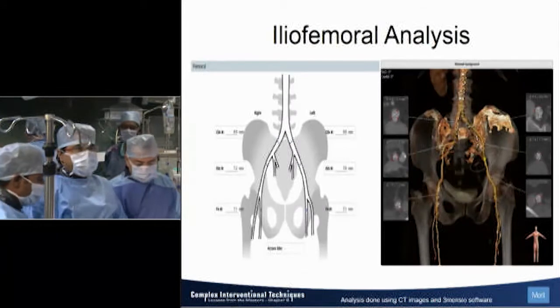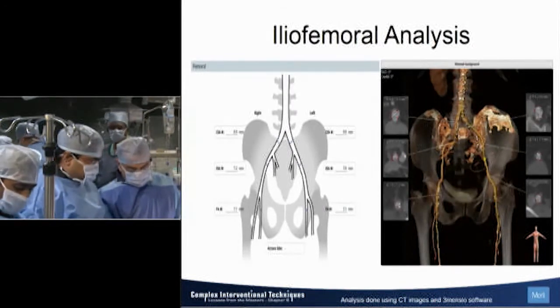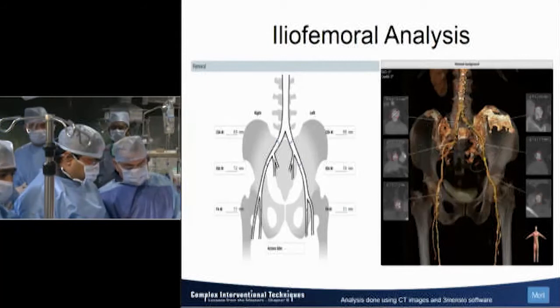Both in the same range, not much of a gradient, but the patient had a big... Okay, fine, I can hear myself.